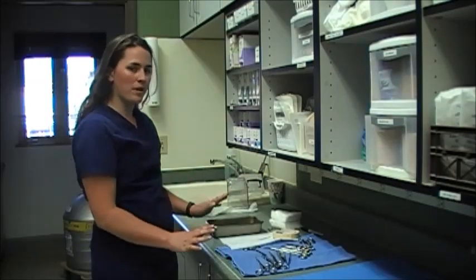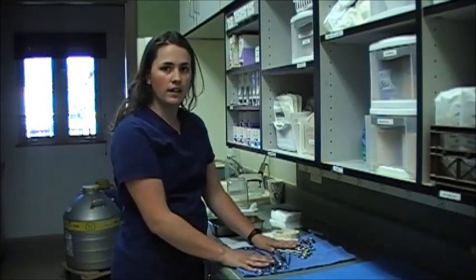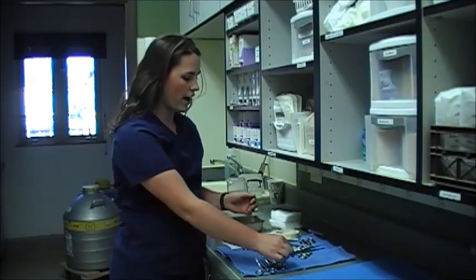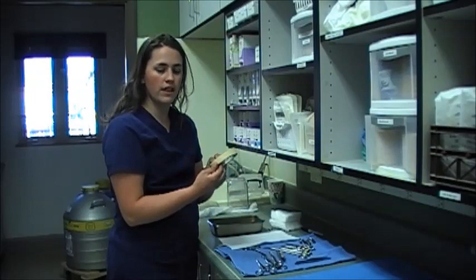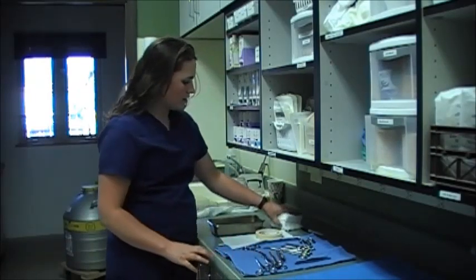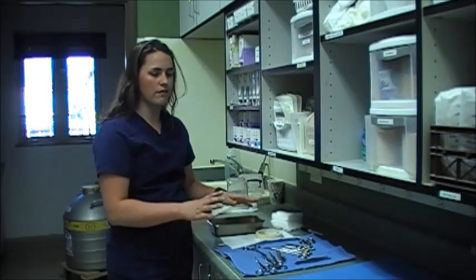Starting out I'm going to gather all my supplies. I've got our tray that we're gathering our instruments in. My instruments are all laid out right here, scrubbed, cleaned, lubricated, and left to dry. I've got my indicator strip to go in my pack, paper towel at the bottom, my indicator tape that goes on the outside of the pack, my wrap to go around the pack, and then some gauze sponges and a scalpel blade that all go inside of this general pack.